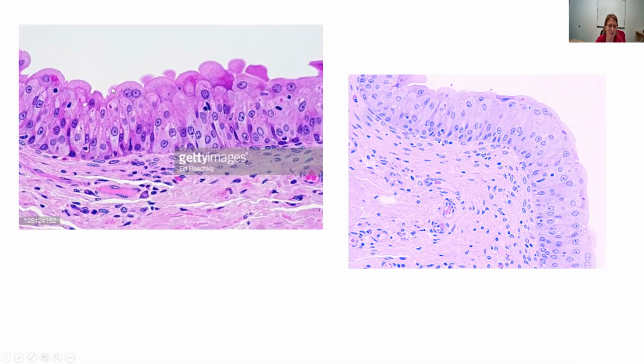And this one just looks a little like, I don't know, some sort of monster peeking, or a jellyfish maybe. These don't look like the squamous, the cuboidal, or the columnar cells. So that is actually a clue on this one. When you've got cells like this that you're just not sure what the shape is, then I start looking for these double nucleated, binucleated is the proper term for it. I start looking for these binucleated cells. And if I can find one of those, then I can feel pretty confident that this is transitional tissue.